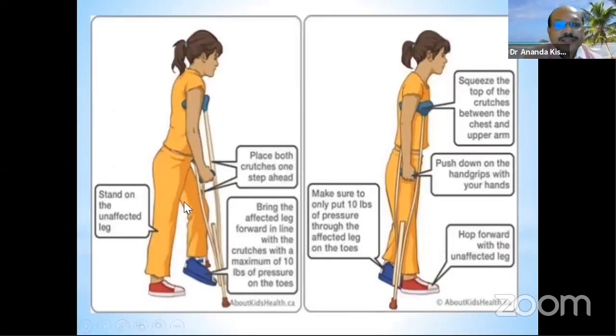So the 3-point crutch gait. What is that? The patient will stand like this. This is a tripod action, known as the tripod. The patient will stand with this right limb, the red boot, being the normal one, and both crutches. This is like a tripod, a very stable situation. On this, the blue boot, this part is the abnormal one.